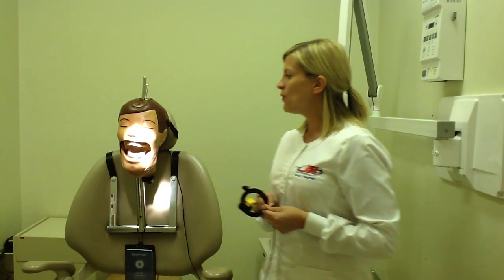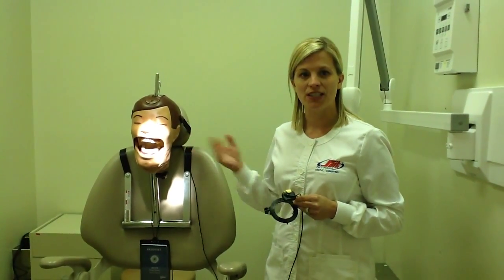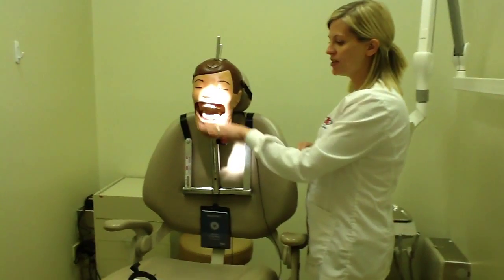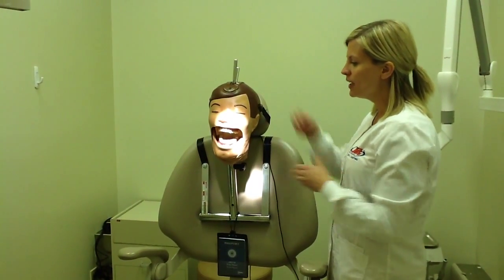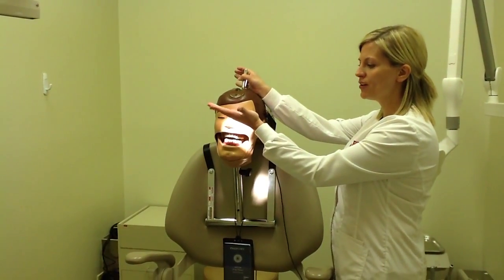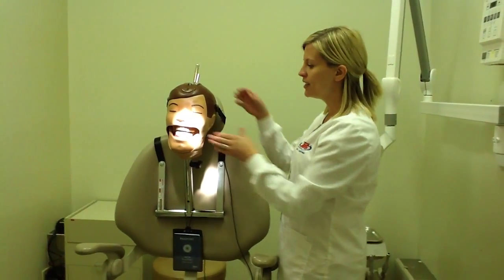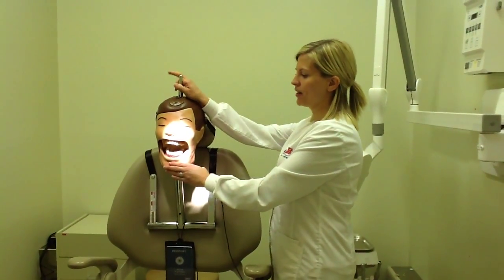So first of all, before we do anything, we want to make sure our patient is positioned properly. With that being said, we want our occlusal plane to be parallel or flat to the floor. When the patient is closed, we don't want their chin to be elevated or down too far to the chest. That'll make it a little bit difficult and alter our positioning. So as close as you can, you want the occlusal plane parallel to the floor.